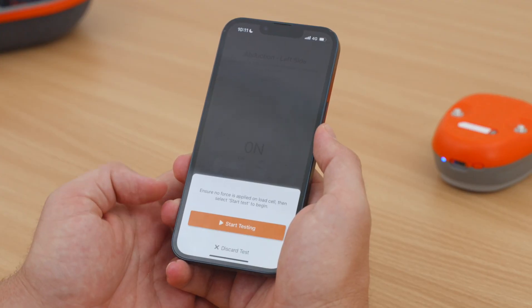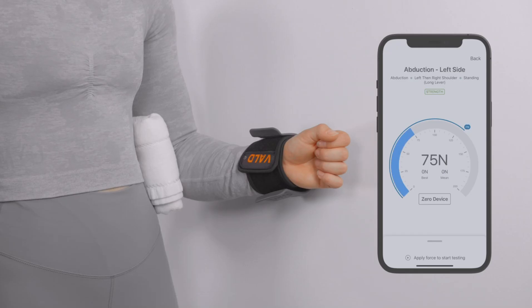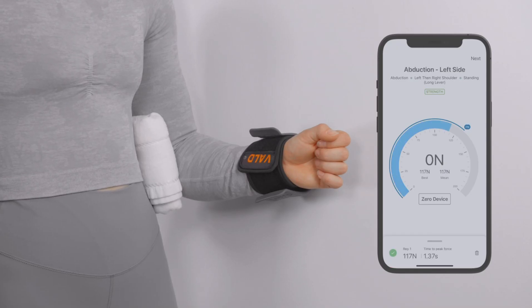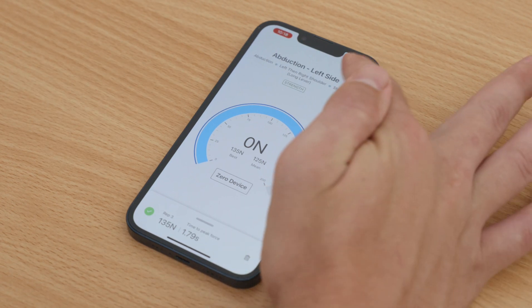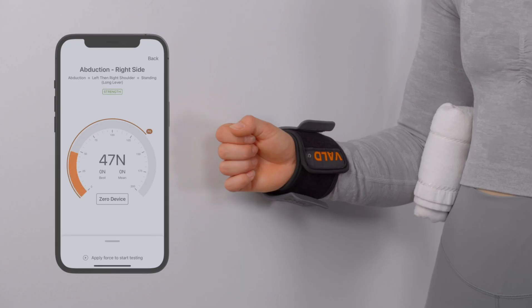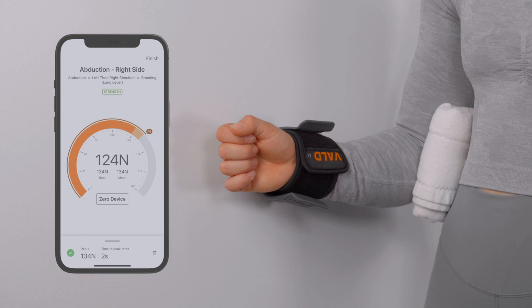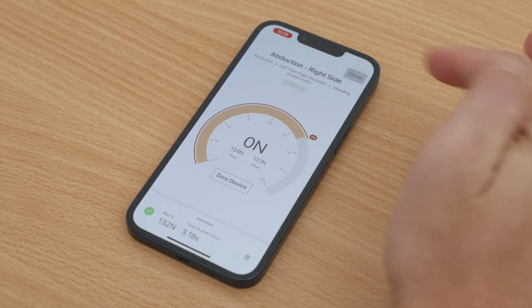When you're ready, click Start Testing. Following the protocol, you will see a force reading as your client pushes against the pad while each rep is recorded in the app. Tap Next to complete the first side, then repeat the test on the other side. When you have completed your test, tap Finish on the app.